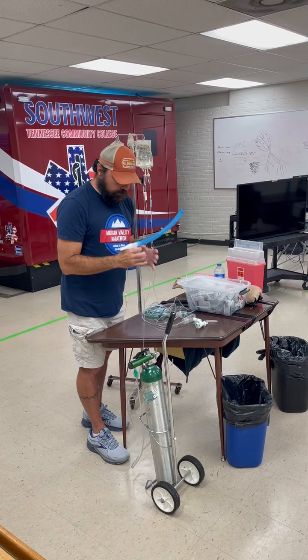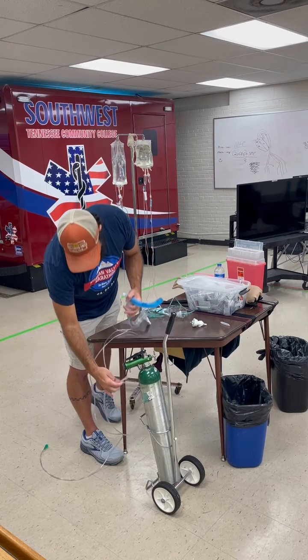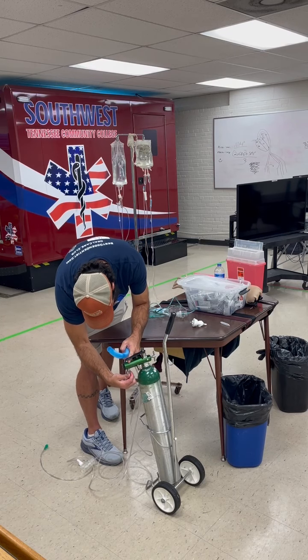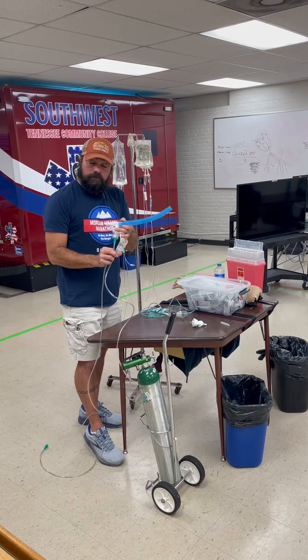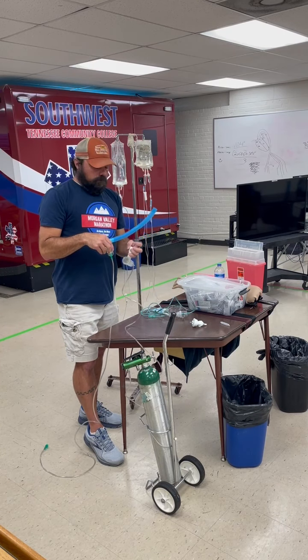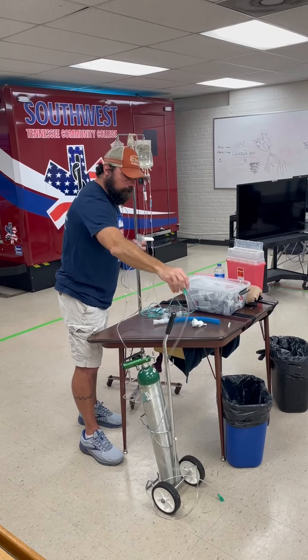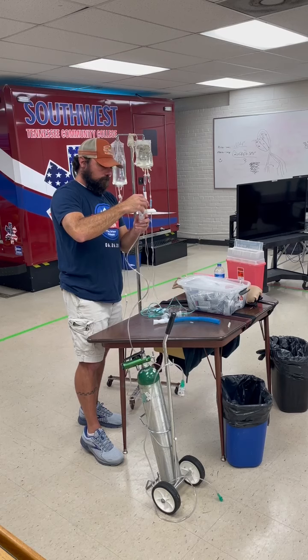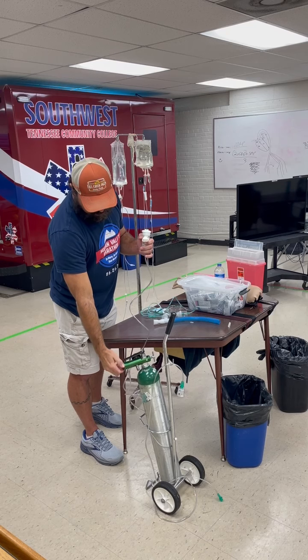So we will hook up this dude. I'm going to show you all of these. Some of your services will have this. Memphis used to have these. I don't know if they still do, to be honest with you. Yeah, we still got the mask ones. Do you have these like this that go with the mask that have the little knob on the top? That's just to keep from wasting medicine, which I'm going to show them. A lot of the stuff usually comes disconnected in the bag, so you have to kind of put it together.